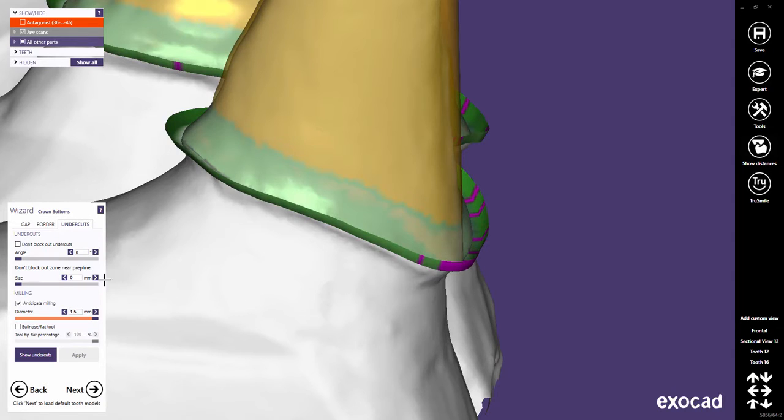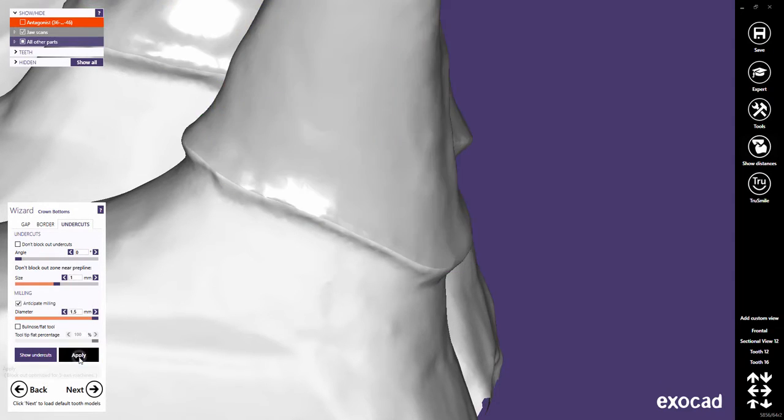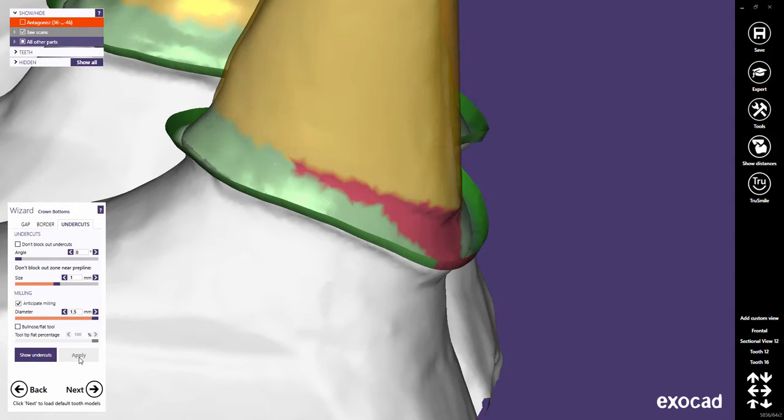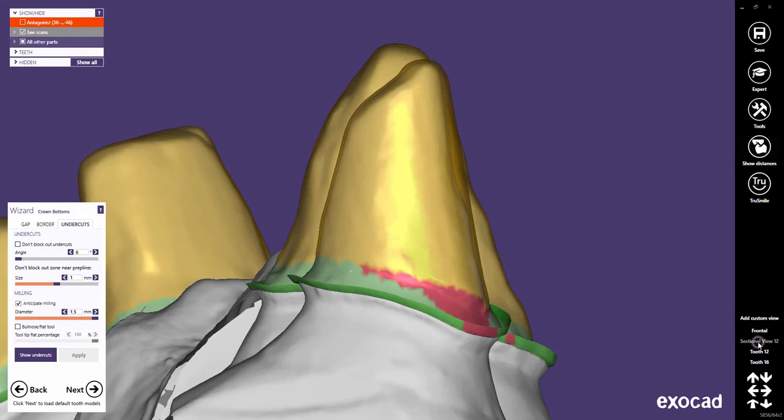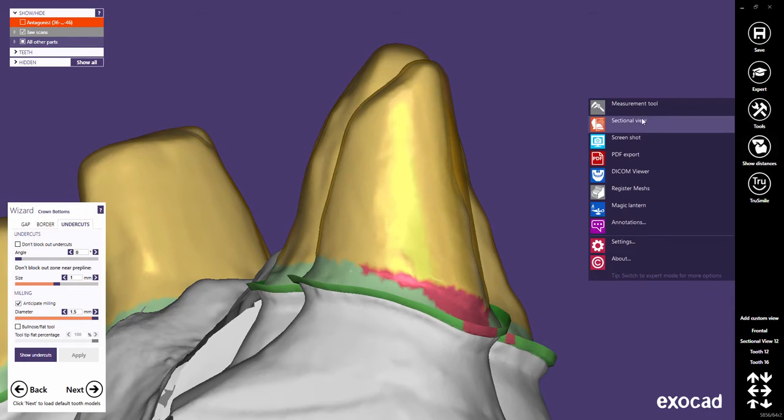In 5-axis mode, I recommend to set this value equal to the cement gap distance. This helps to ensure that the crown is completely in contact with the preparation in the green area. Let's switch back to the sectional view.